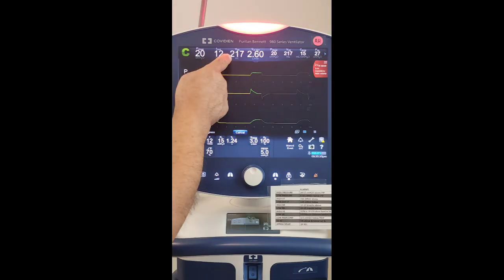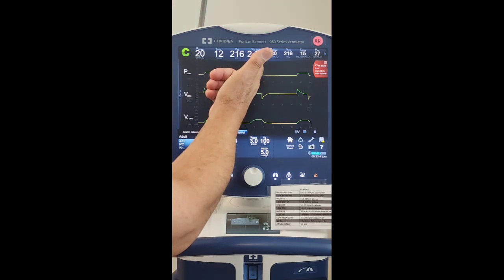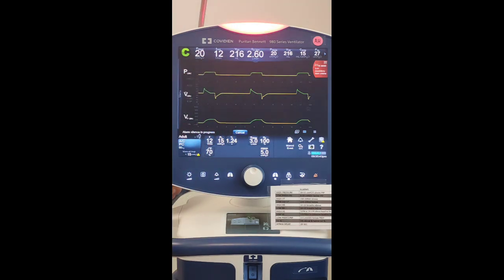And you can see now your tidal volume is significantly reduced, less than half. And look at our minute ventilation, it's 2.6. So the question is, we need to maintain a minute ventilation of the way it was when we started, 6 liters per minute. Right now it's 2.5, 2.6 liters per minute, significantly less. Okay, so how can we correct this?